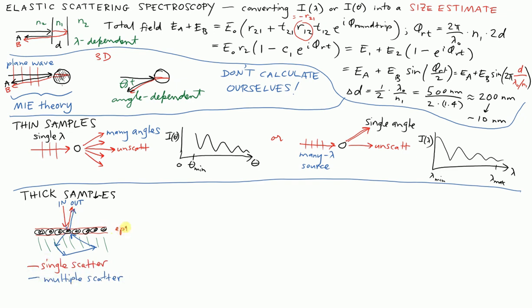And just to label this top thing here is what we might call some epithelial tissue, as I said. And then these down here are just some lower layer. It will depend upon where you are in the body. Okay, so we're going to play a trick here that's going to enable us to analyze single scattering from this cell layer or small thickness region as if it was like this case where there was no layer beneath it. Seems hard to do that. However, we're going to exploit a particular thing. We're going to exploit polarization of light.